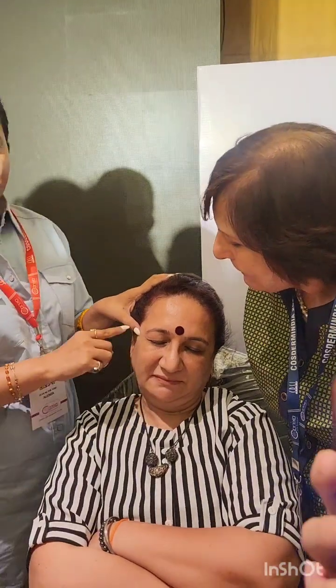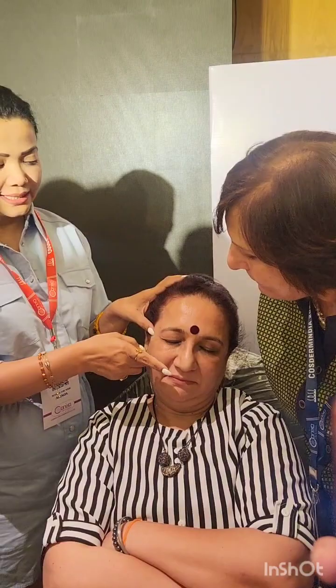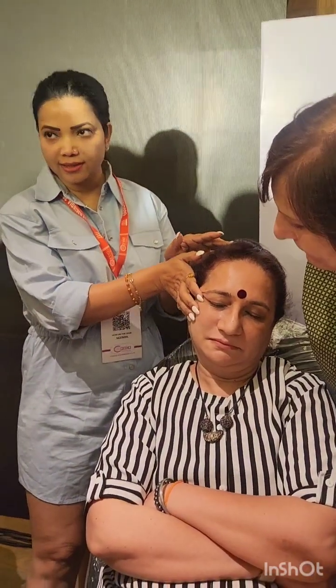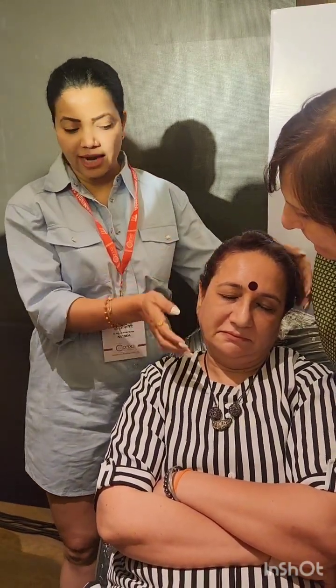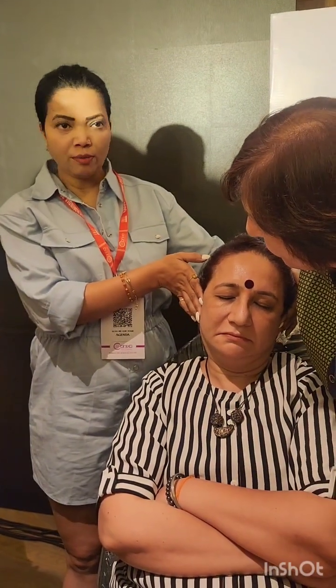So I can exit at multiple points. Why? Because that will pull up the entire skin if we want to. Got my point? Any questions?